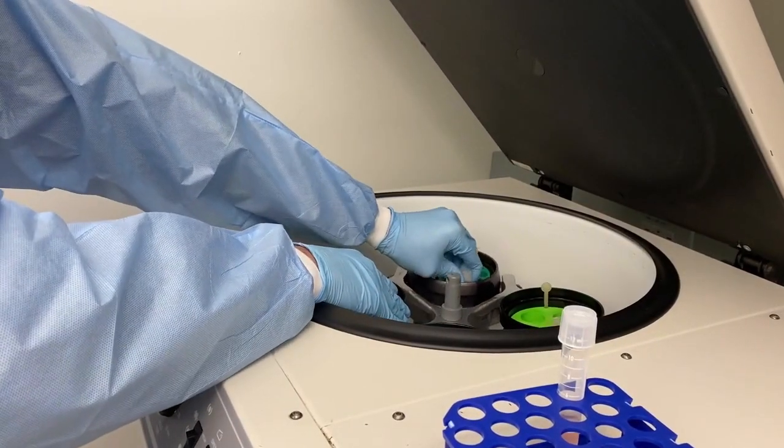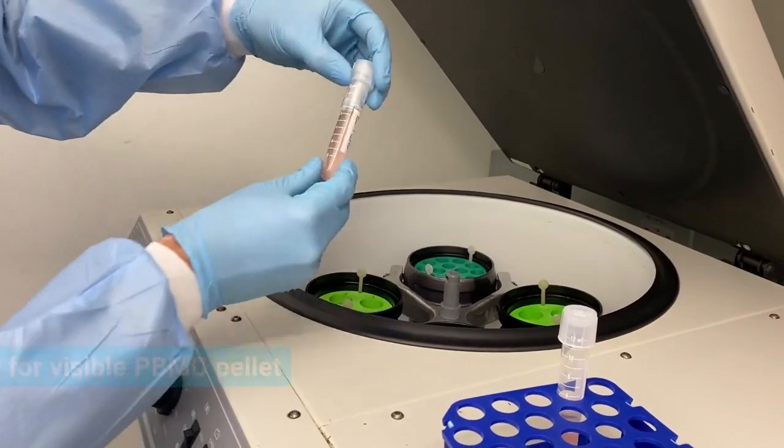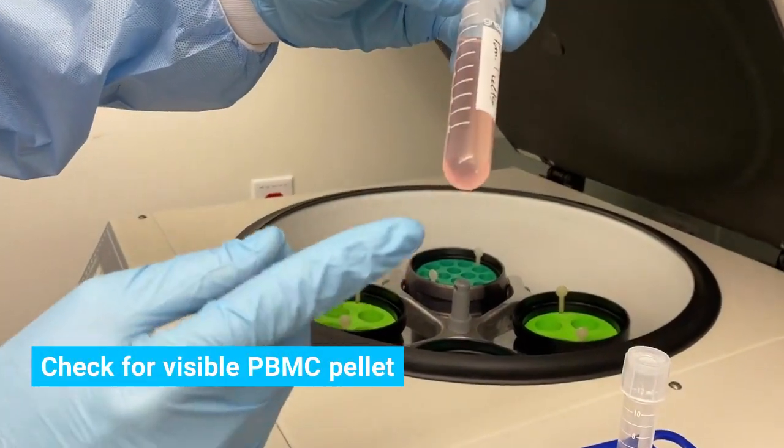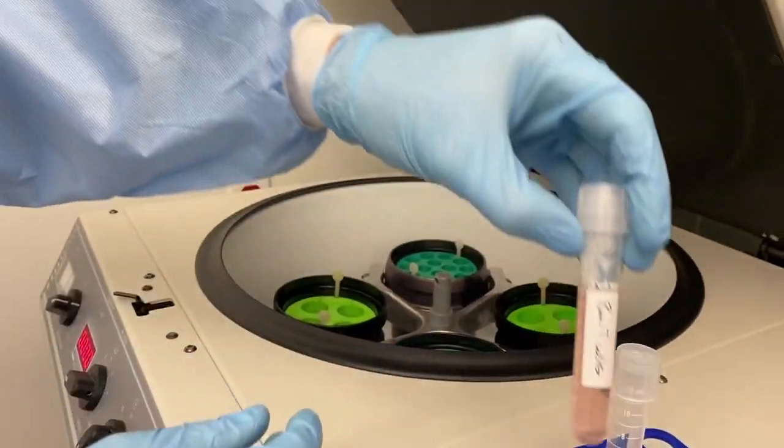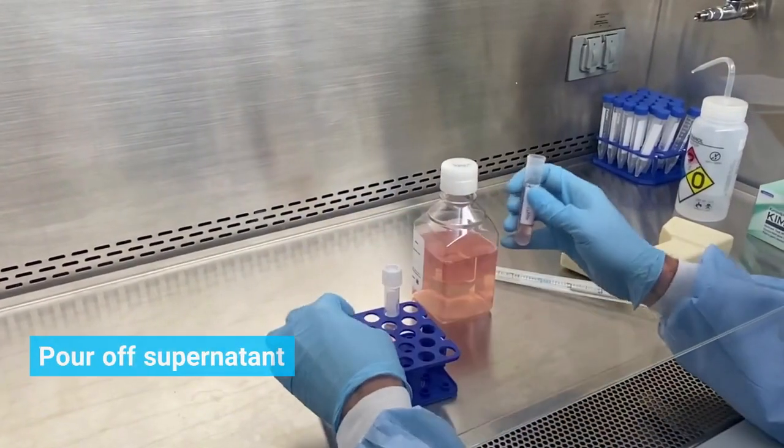When finished, a PBMC pellet should be visible at the bottom of the tube. Pour off the supernatant.